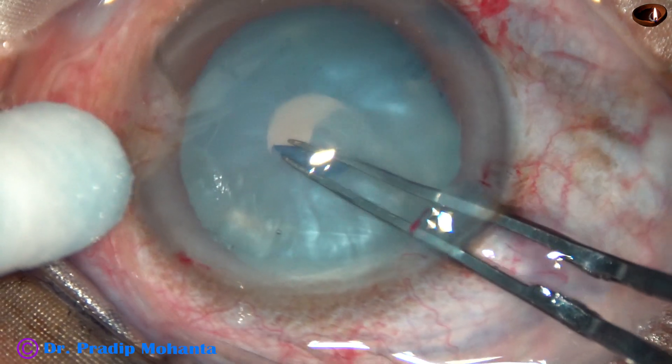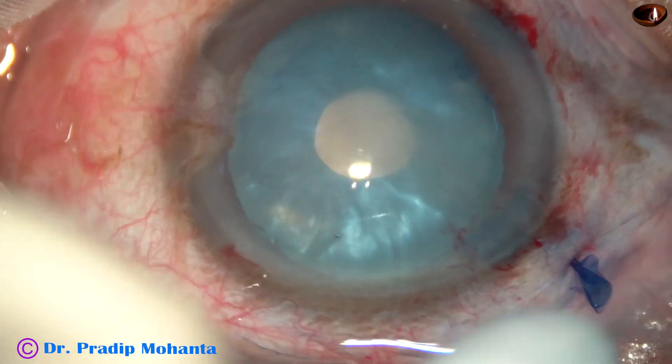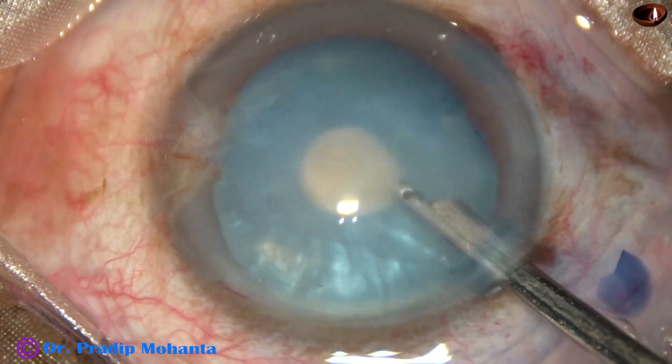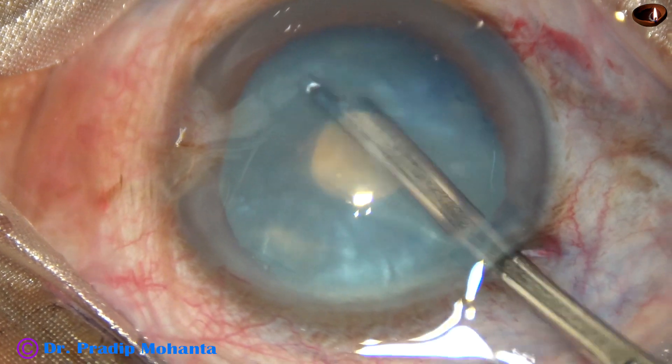Don't try to do a large rexis at this stage. This mini-rexis can resist radial extension when you attempt to remove some cortical matter.